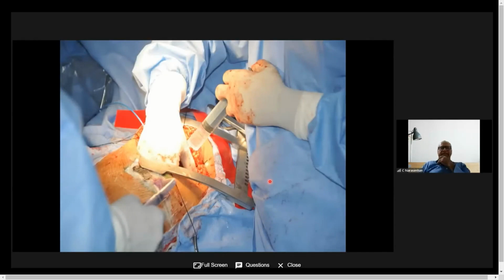Very, very rarely, you may have a lot of adhesions. This is common in patients who have post-bypass or a lot of adhesions due to previous pericarditis. We'll first localize the VT in the lab and then call the surgeon to expose that area. You take an angiogram, because surgeons are always familiar with the angiographic anatomy. You take the angiogram and say that this area of VT is coming close to the OM1 or OM2. They will plan the incision accordingly.